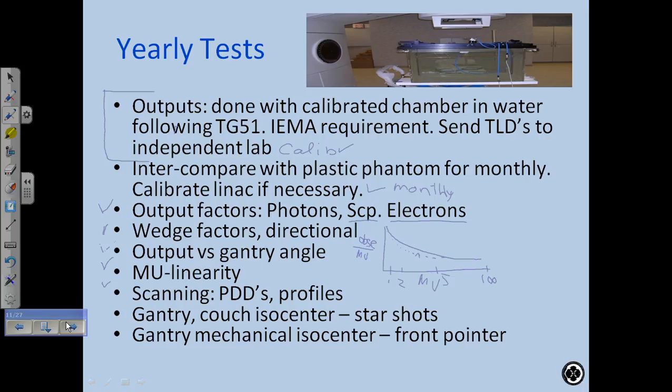So the chiller water goes into the Linac. Remember that water cooling system when we were talking about it? So the chiller water comes in. If the chiller's down and the Linac is overheating, that can actually affect PDD. I've seen PDDs look completely wrong when the Linac was overheating. So you might spot an overheating Linac issue if your PDDs are off.